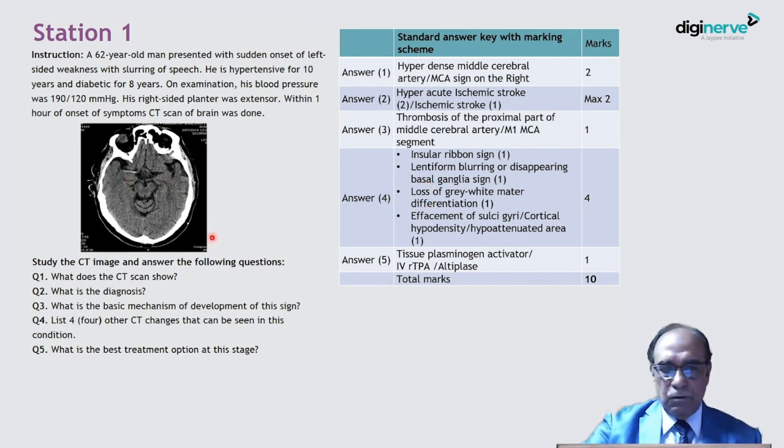And loss of gray matter white matter differentiation. There is loss of gray matter differentiation. And effacement of sulci gyri. Or you can write cortical hypodensity. Or you can write hypoattenuated area. This means all the same. So you can see there is effacement of the sulci gyri or there is cortical hypodensity.